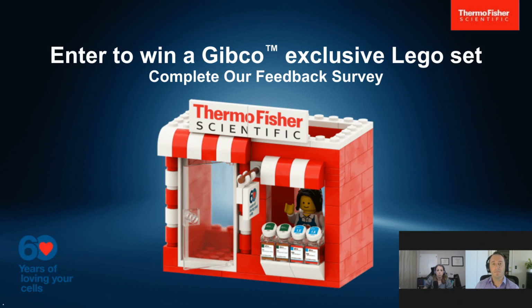The larger pore sizes, like 8 microns, are what's recommended for studies where you would like to see the cells migrate: chemotaxis, invasion studies. I would recommend checking out the application notes on our website, and that should help guide you into which cell culture insert product would be appropriate for your study of interest.